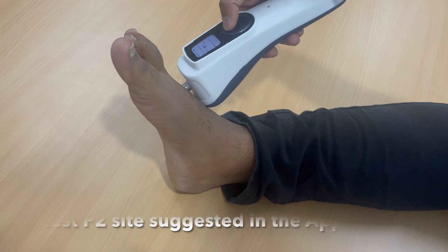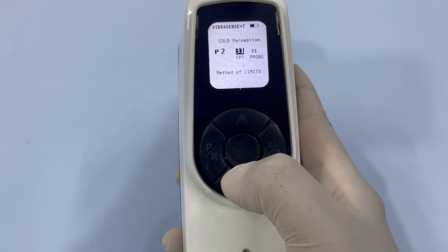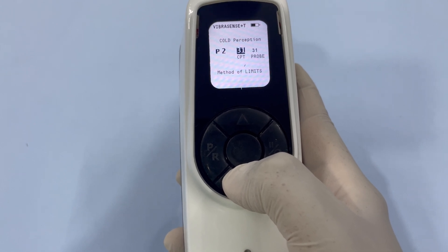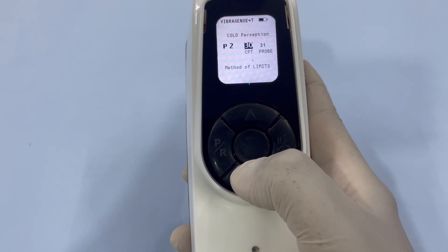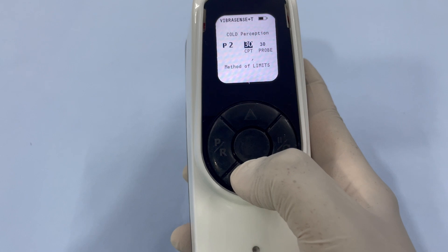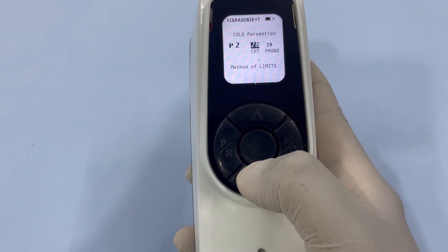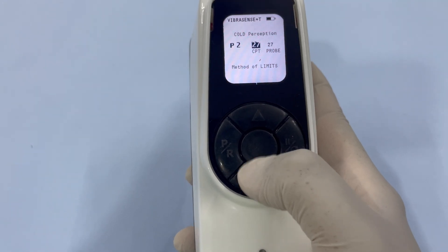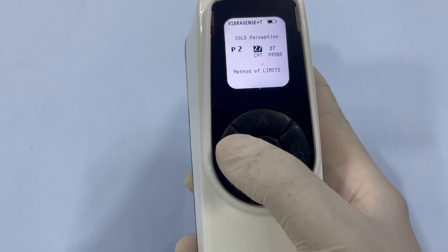Then repeat the procedure at P2, reducing the temperature until the subject confirms feeling cold. Proceed to test at P3 and P4.